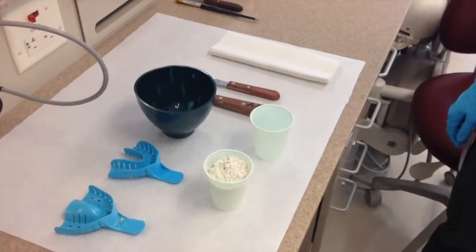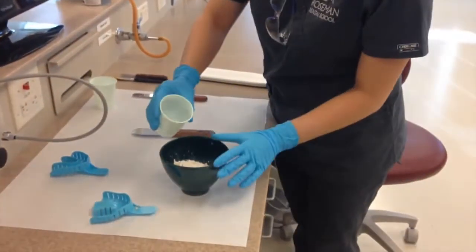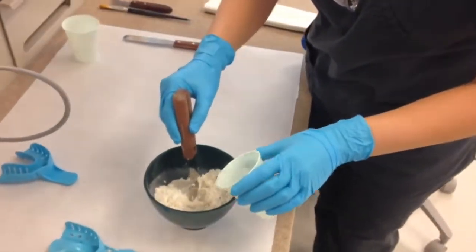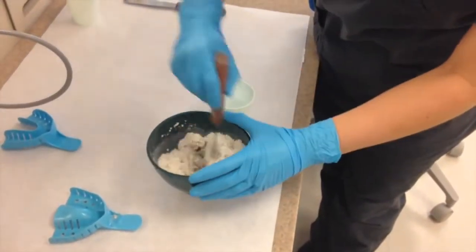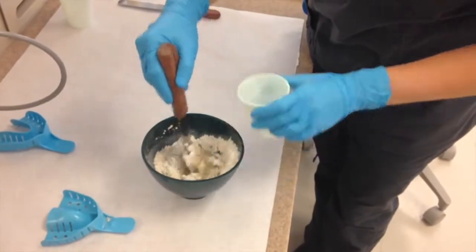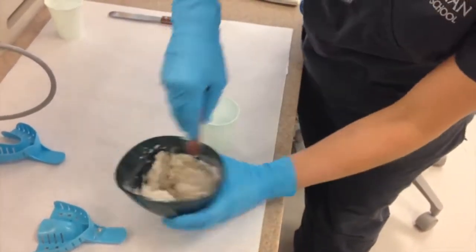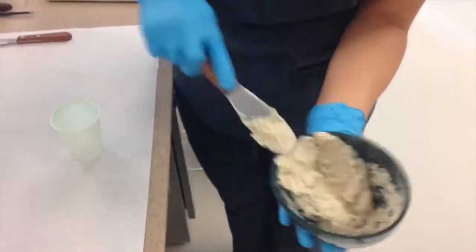Now you're ready to mix your alginate. First, pour the powder into the mixing bowl. You can add the water all at once or a little bit at a time. Use the end of your spatula to incorporate the water into the powder. Once that's done, you can begin to cream the alginate against the side of the mixing bowl. This helps to remove bubbles.